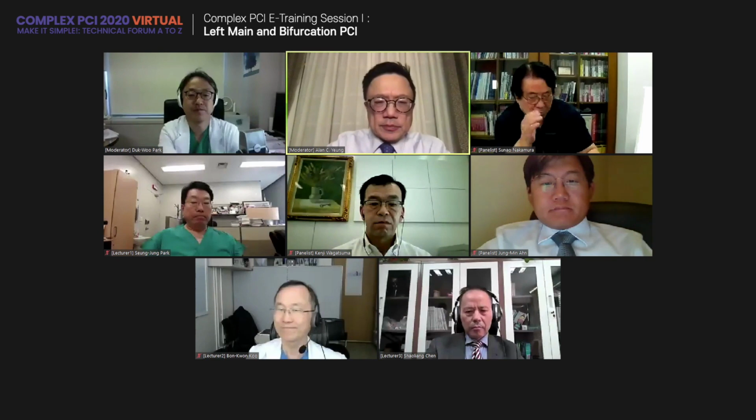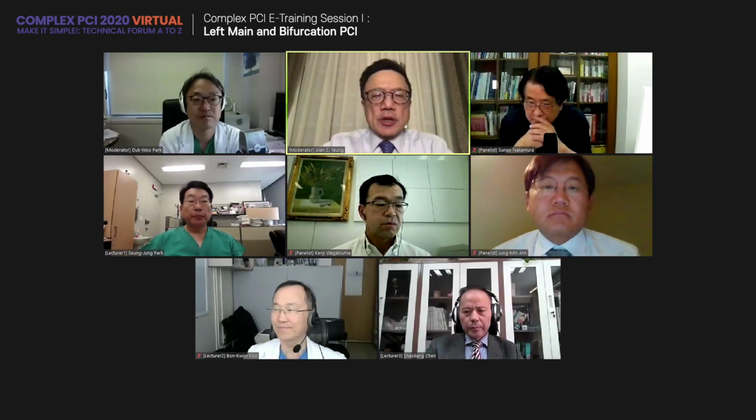Thank you very much, Shaoliang. So now we have about 20 minutes, and I would like to have some discussion about left main PCI and also the technique as well. Maybe I'll start with one question or just a comment. In left main interventions, obviously we always compare to bypass surgery. As you know, the EXCEL trial now has up to 5 years of follow-up. Most of the time, in the first year there's really not a whole lot of difference in terms of TLR. It's really after the first year, up to 4 years, that there are more ischemia-driven TLRs in the PCI arm.